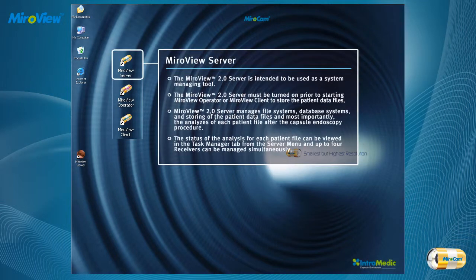The MiroView 2.0 Server is intended to be used as a system managing tool. The MiroView 2.0 Server must be turned on prior to starting MiroView Operator or MiroView Client in order to store the patient data files.